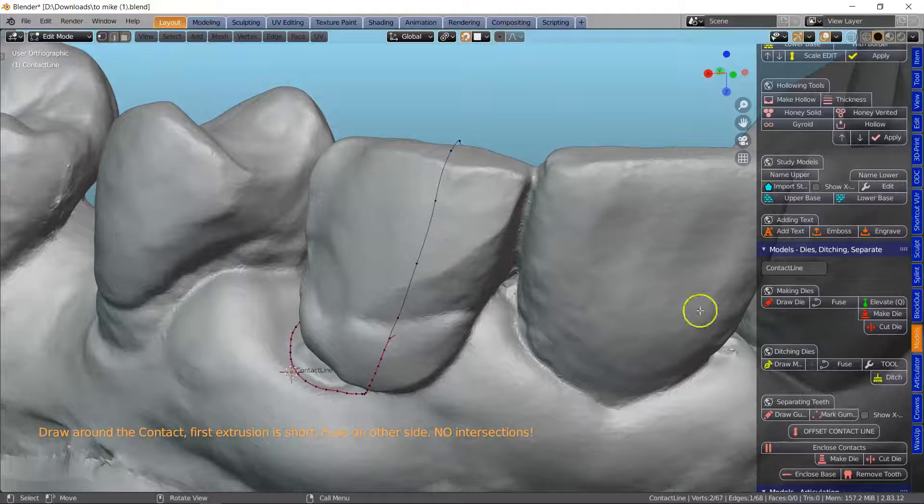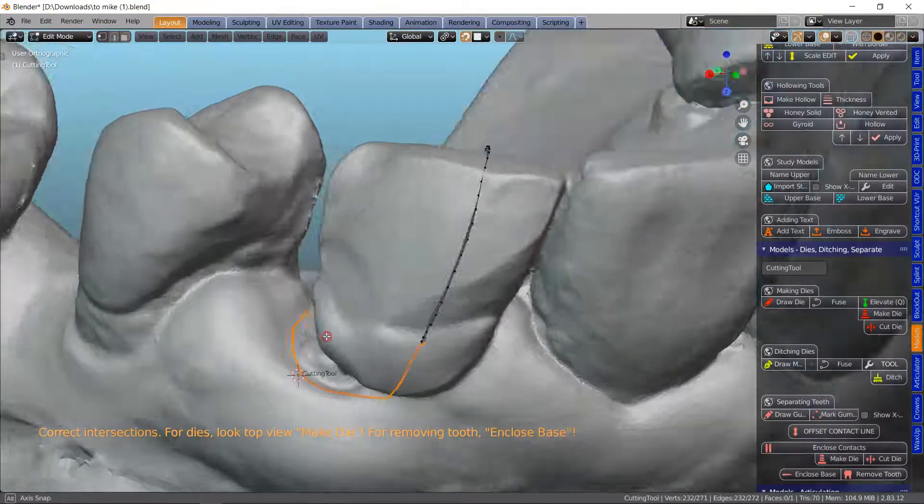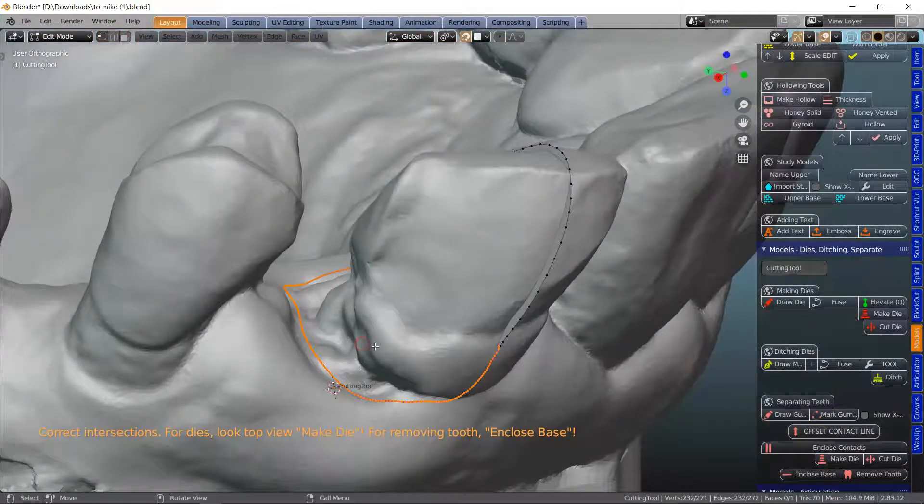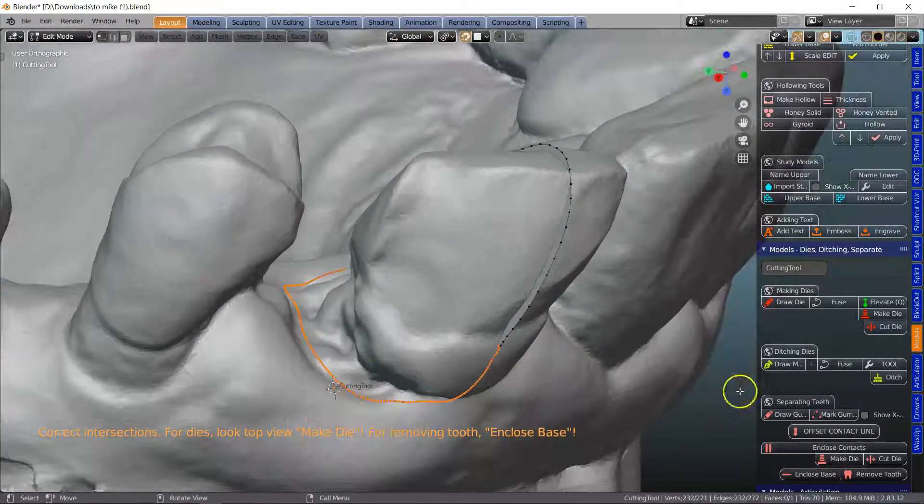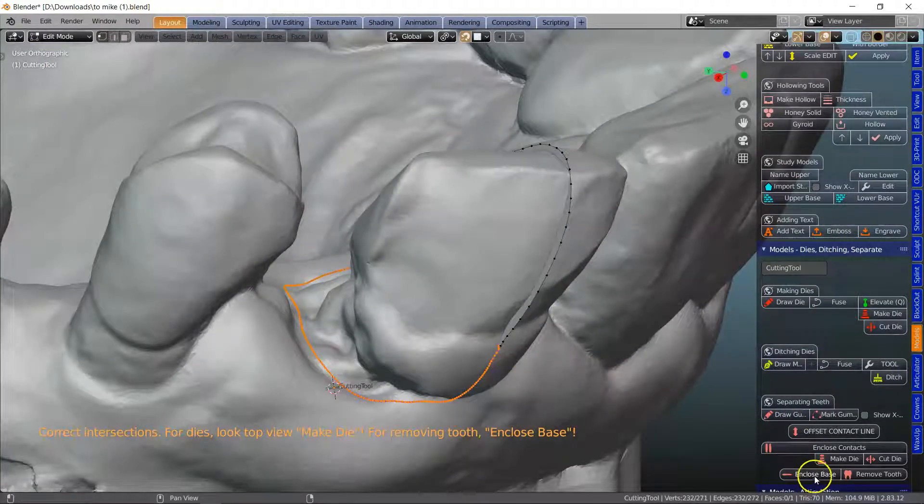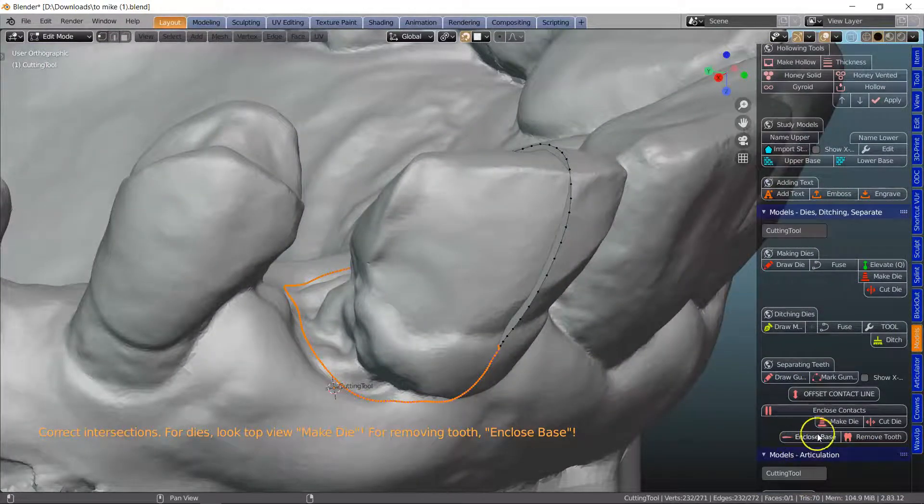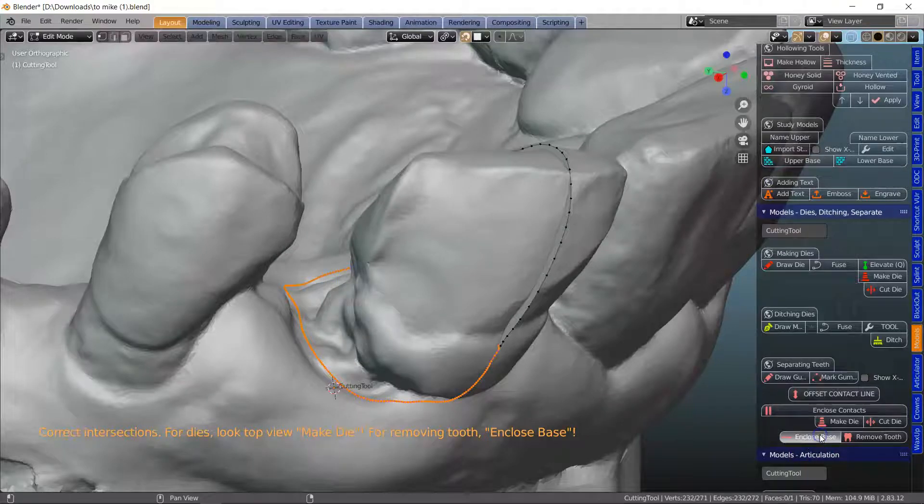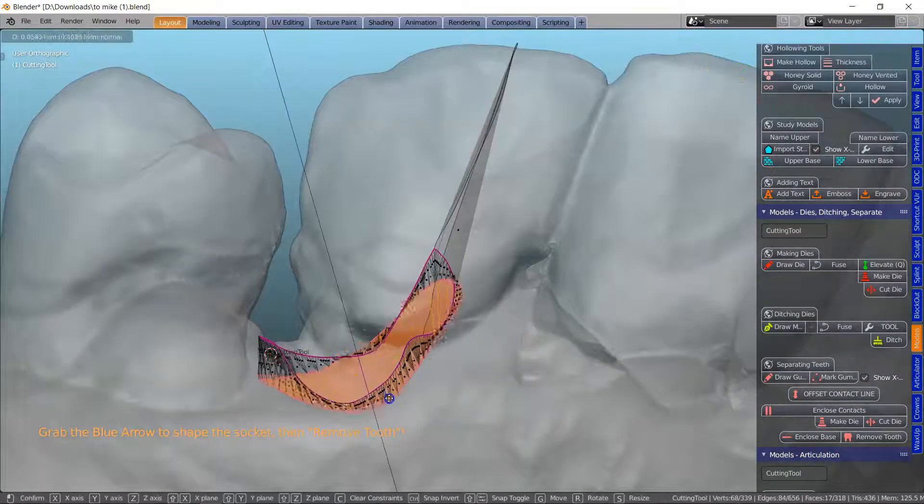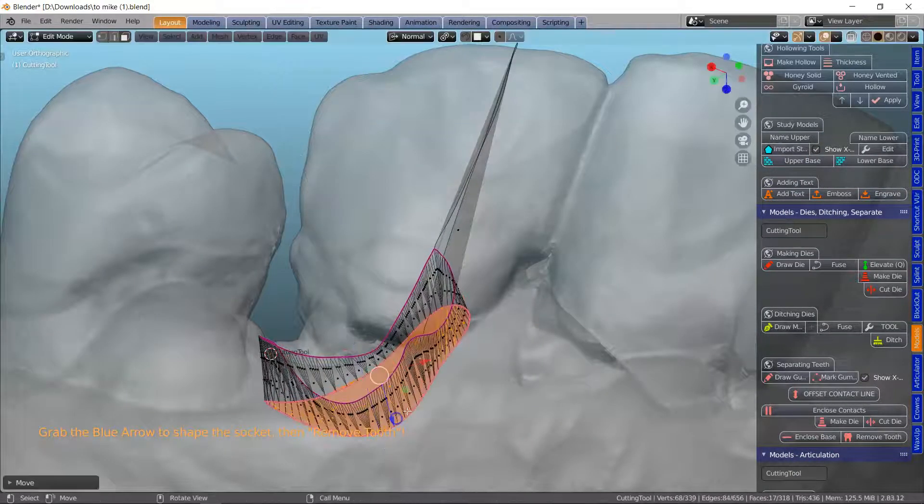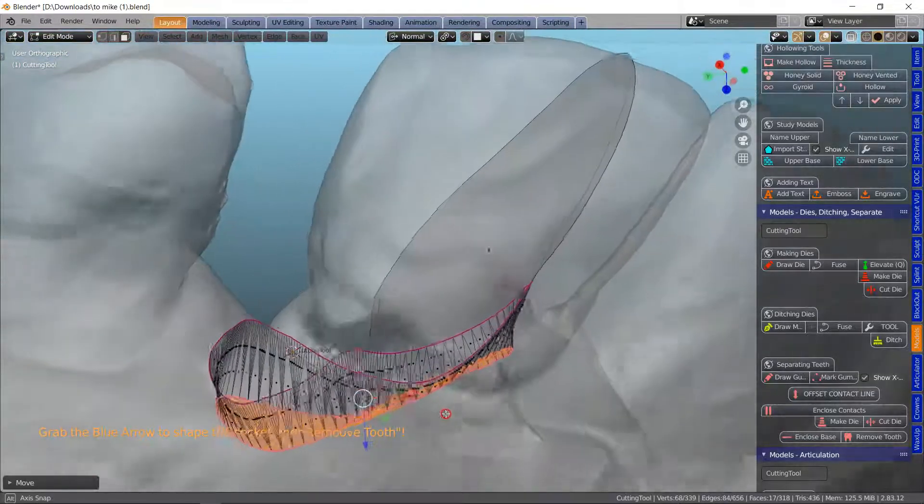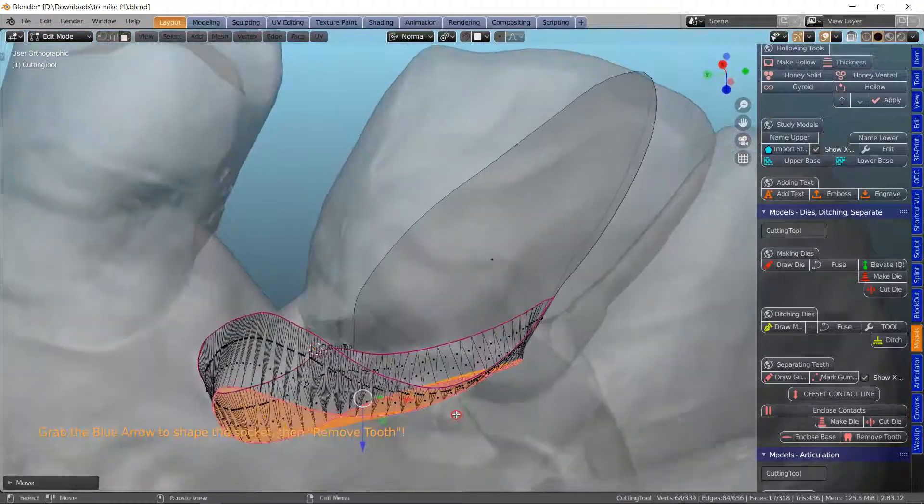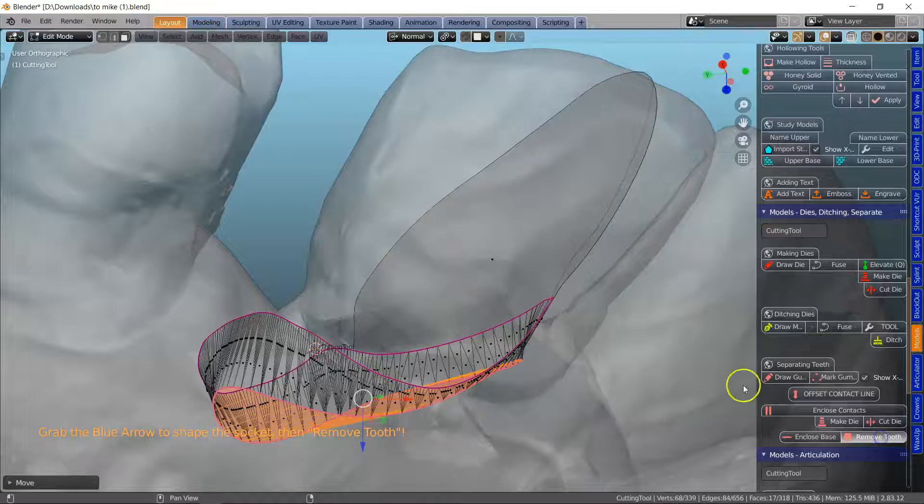So let's see what happens. So enclose contact, yep that's good and then we're going to do enclose base and I'm going to move this down a little bit. Okay, that's looking nice and then we're going to remove the tooth and see what happens.